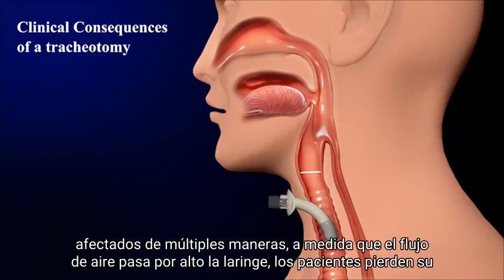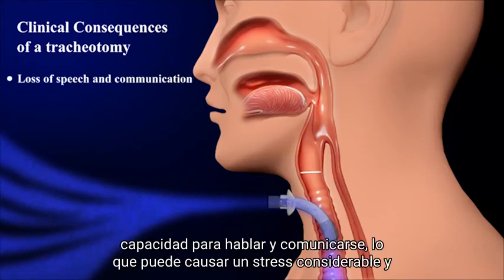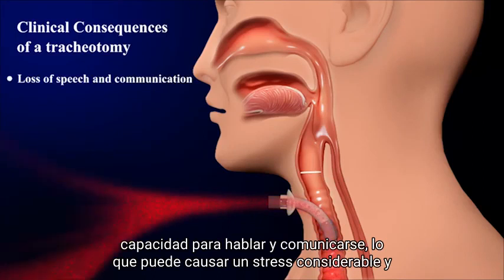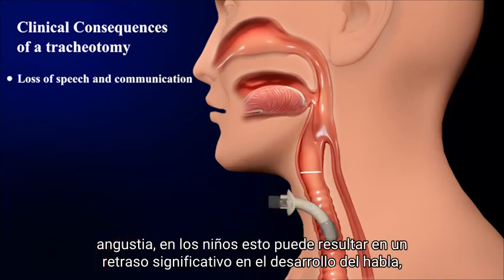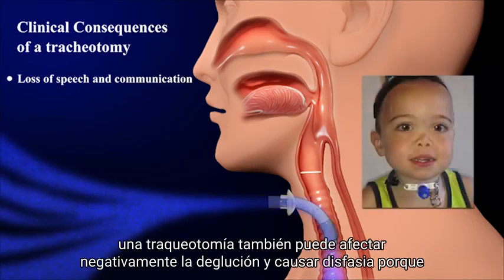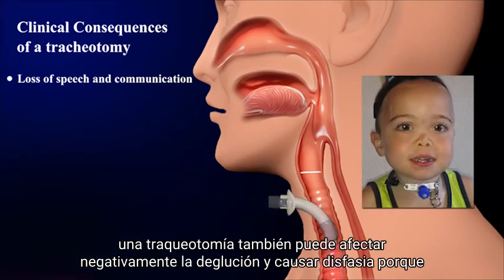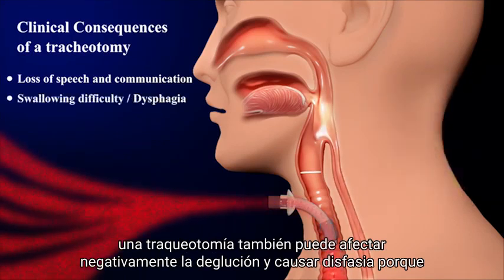As airflow bypasses the larynx, patients lose their ability to speak and communicate, which can cause substantial distress and anguish. In children, this can result in a significant delay in speech development. A tracheotomy can also adversely affect swallowing and cause dysphagia.